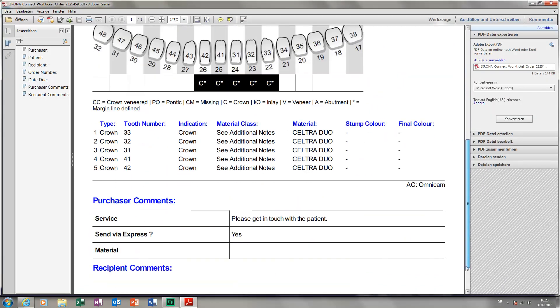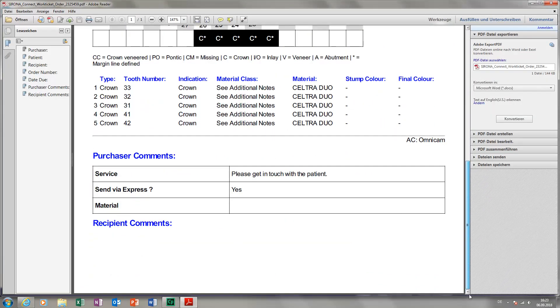You can also display the details of this order in the SIRONA Connect portal by clicking on Ticket. A PDF file is opened in which you can see further comments by the ordering clinic. In our case, this is the request to set up an appointment with the patient, as well as send the restorations by express.